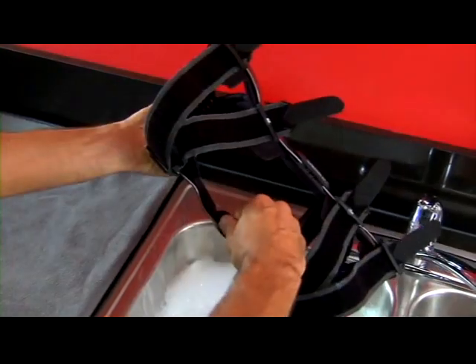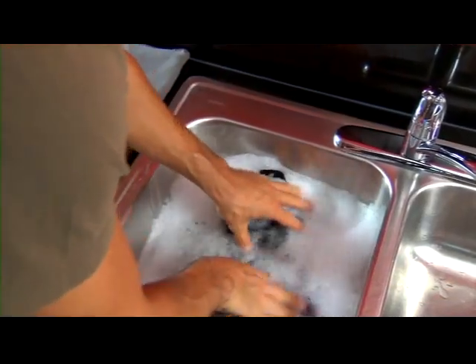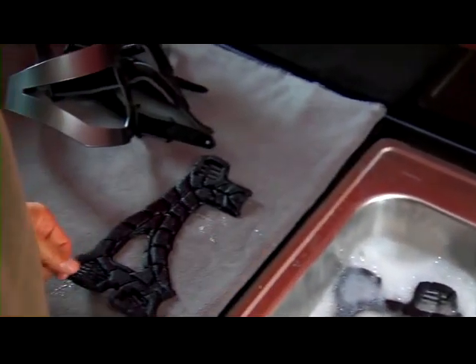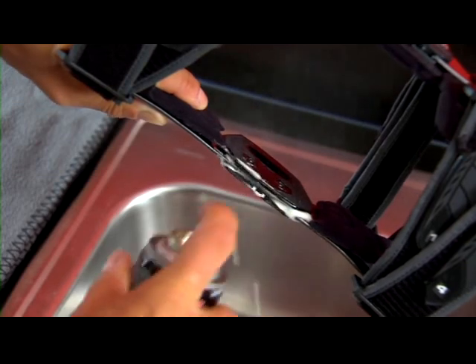You'll need to clean your LPR brace regularly, depending on how active you are and how much you perspire. To clean your brace, remove the frame pads, condyle pads, and straps. Hand wash brace parts in cold water with mild soap, then rinse and air dry. Occasionally you may want to apply a dry lubricant to the hinge, especially if you've worn your brace in water. Don't use WD-40 or other solvent-based products, oil, or grease, since they can attract dirt to the hinge.